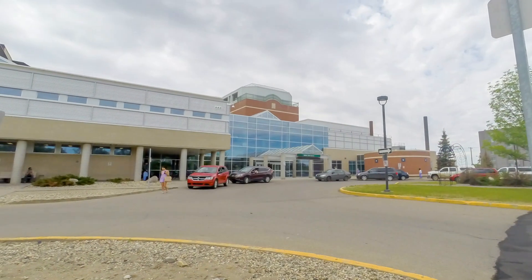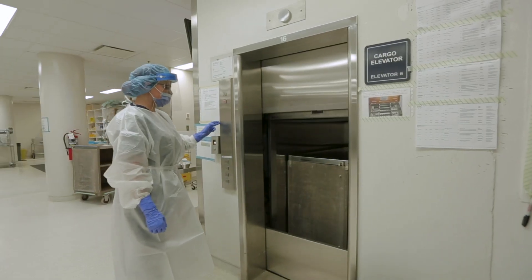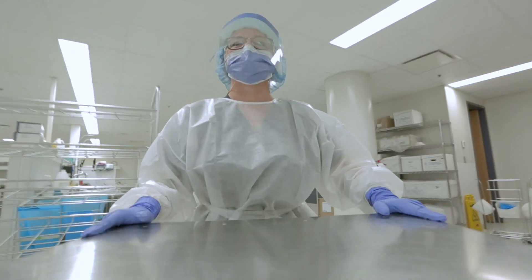The Medical Device Reprocessing Technician program offers education for students to learn how to disinfect, clean, repackage and sterilize surgical instruments and equipment, which assist healthcare professionals in the delivery of patient care.